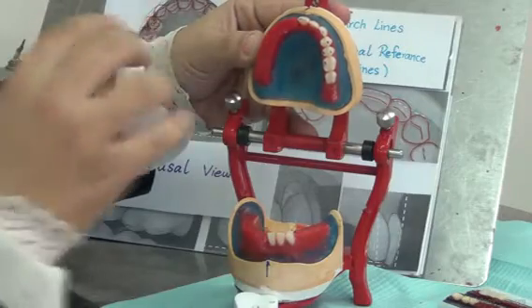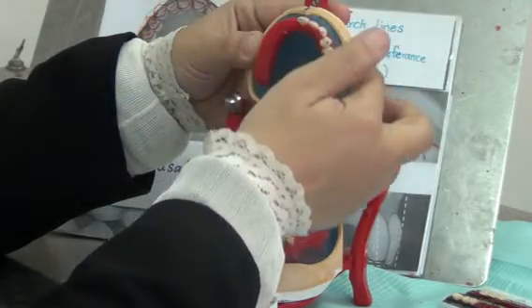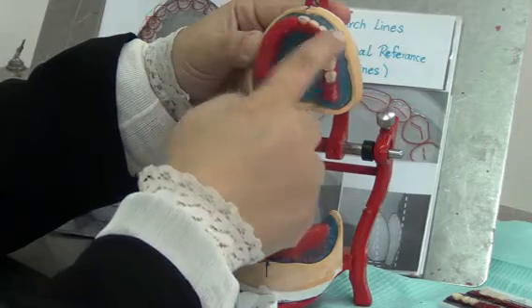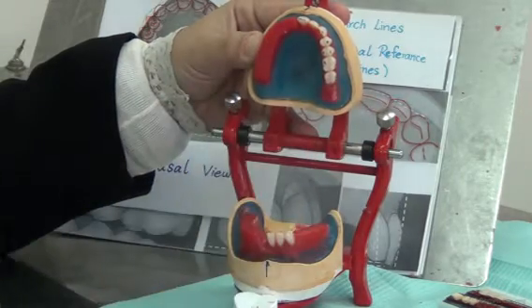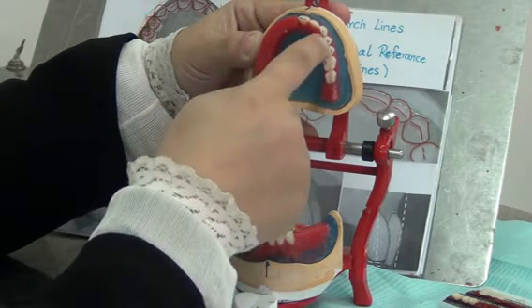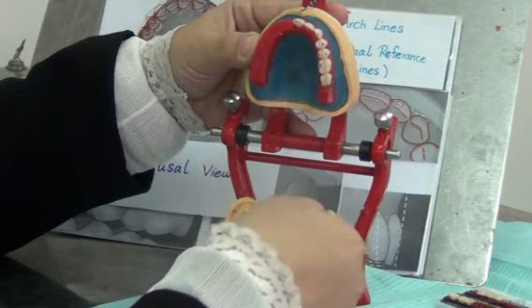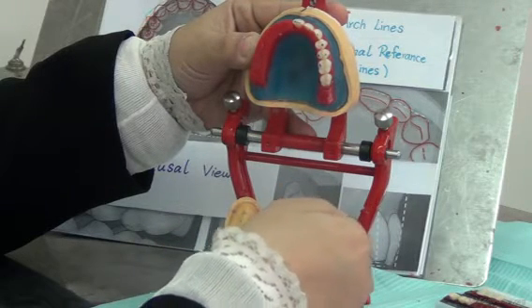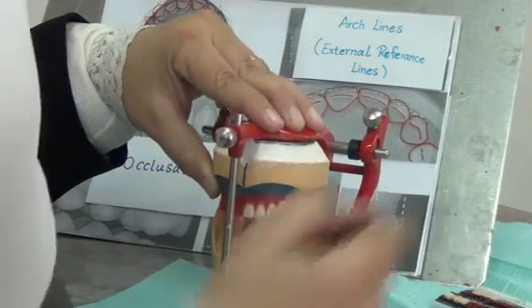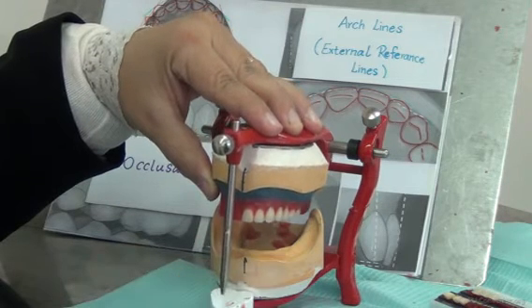So if we look vertically down in this direction, we should see that the arch of the teeth and the arch of the base plate are in the same line. So we don't go away, especially in the anterior area. In the molar area, we are allowed to have 1 or 2 millimeters inward movement of the teeth. The palatal cusps of upper teeth are coinciding with the lower ridge crest line. So if this is the lower crest, if we come closer and compare the position of the crest with the palatal cusp, we find that the cusps are over the center line, over the crest of the ridge.